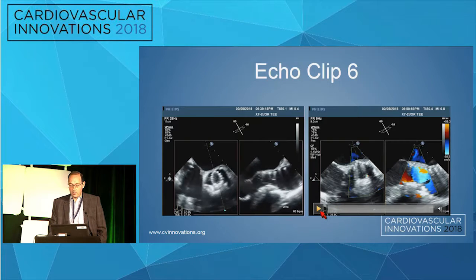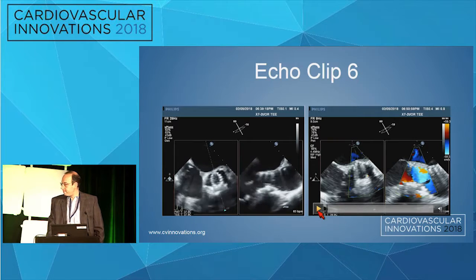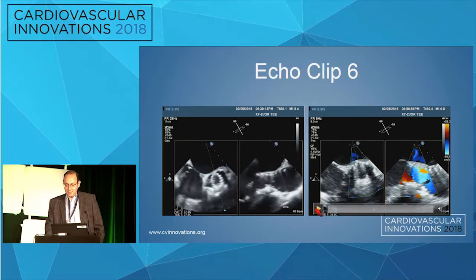Why'd you choose a Z-Med? I'm just curious, as opposed to a less compliant balloon? Yeah. We typically do them with the Z-Med. We do not carry the True balloon, and we order them if we want to frac a valve. I'm sorry, Adnan, I used the word frac, but we usually do not.